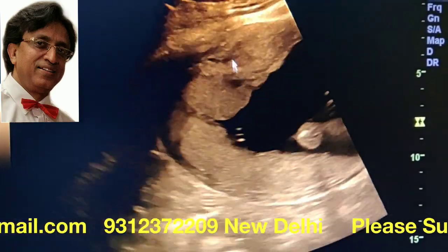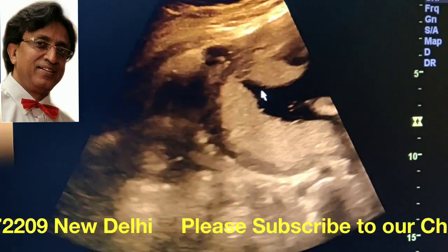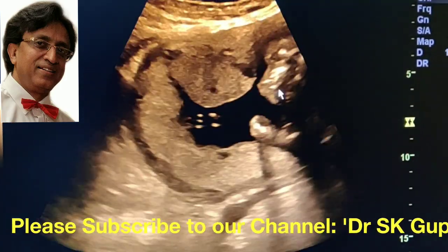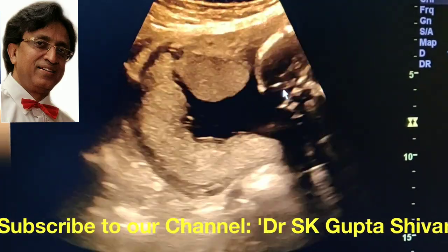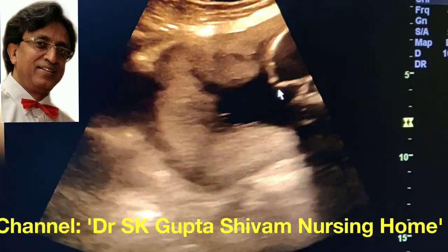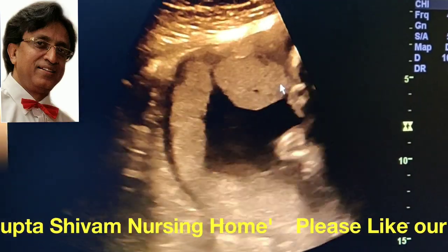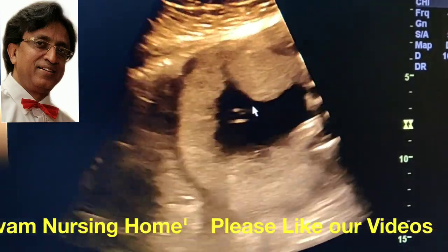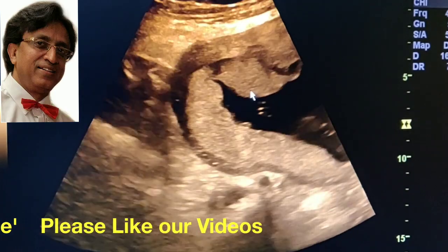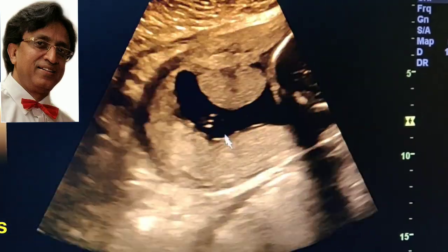How do we differentiate this succunturiate lobe from a uterine contraction? You should repeat the ultrasound after 15 to 20 minutes, and if this lobe and its morphology persist, then you may surely say that this was a succunturiate lobe.